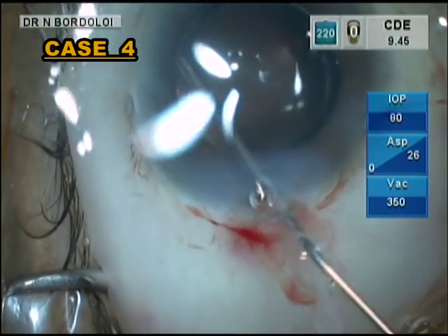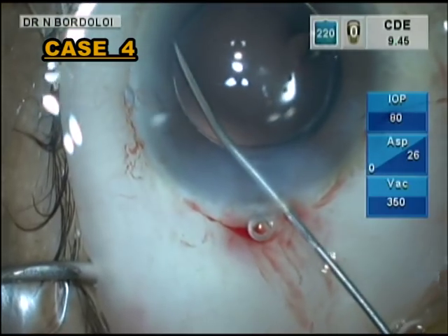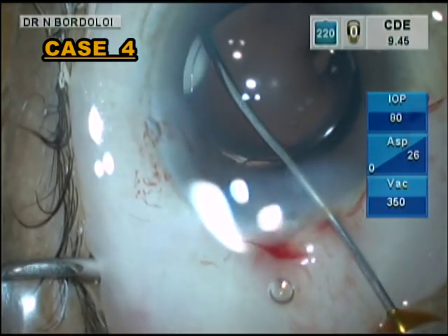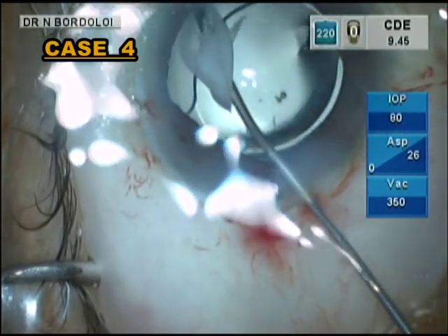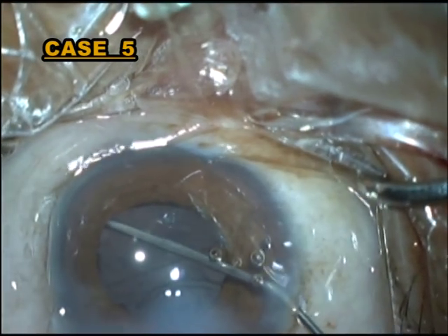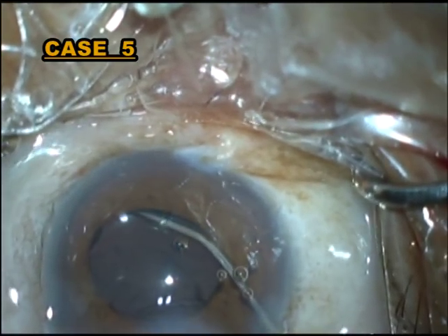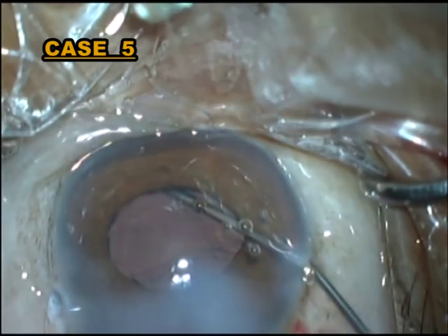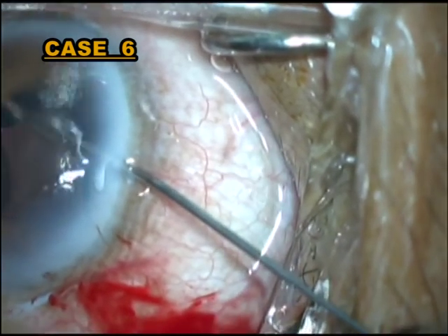Here is the technique: going into the trans-zonular space with a 27-gauge cannula, then injecting there. Many times some amount of the solution comes out through the hole we have made in the zonules, but when you wait for some time, everything settles down. Here you can see we are injecting moxifloxacin and triamcinolone acetonide — and here it goes. All the amount has gone into the vitreous cavity; some has percolated back into the anterior chamber, and that is not a big problem.